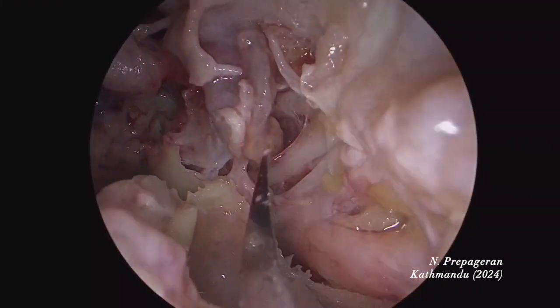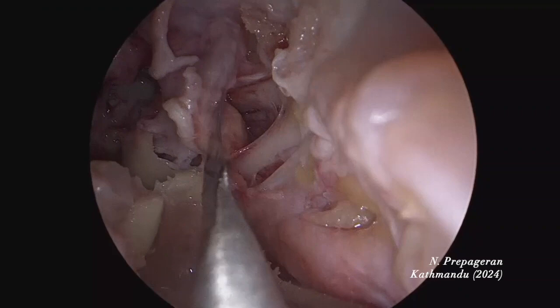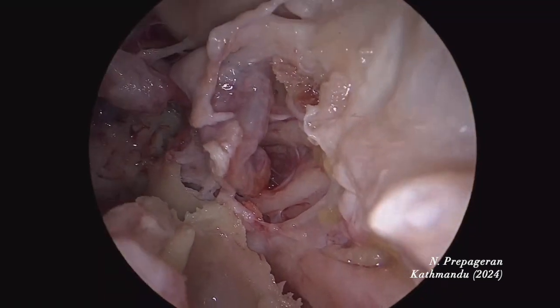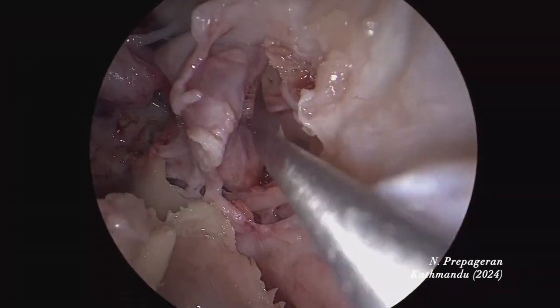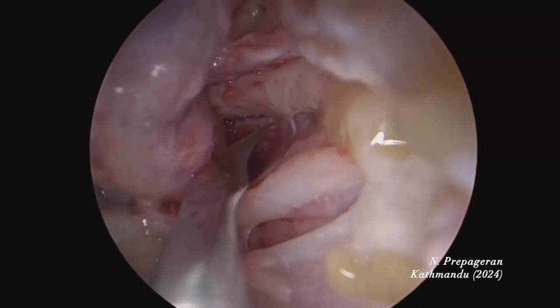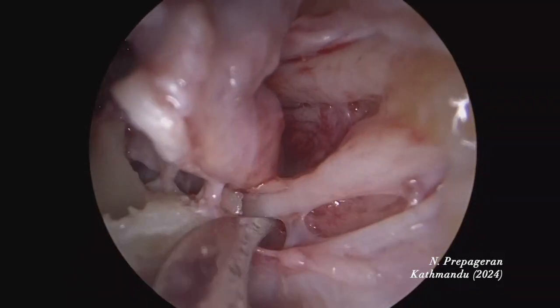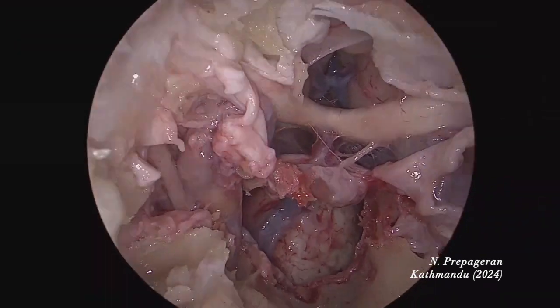Now we're opening the cavernous sinus again — a very nice one because you can see the sixth nerve. The big one here is the third. The fourth will be very small, so we need to open a little more. I'm pushing the carotid artery away. Three, four, this I think is six — it's not V1. V1 is at the back because six is hanging free. This is six. V1 is at the back there.